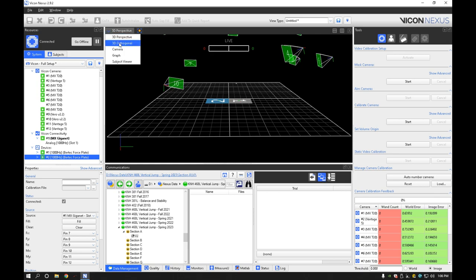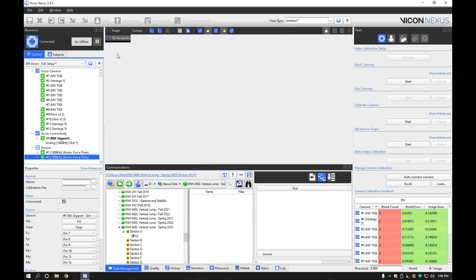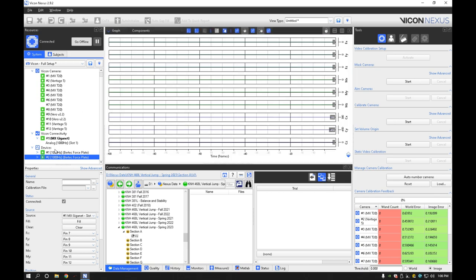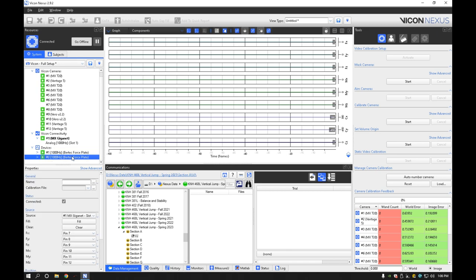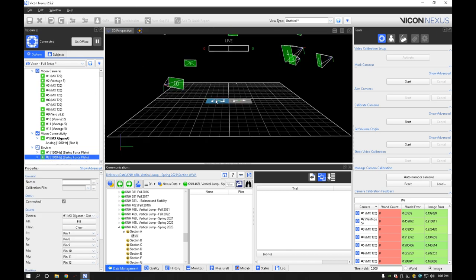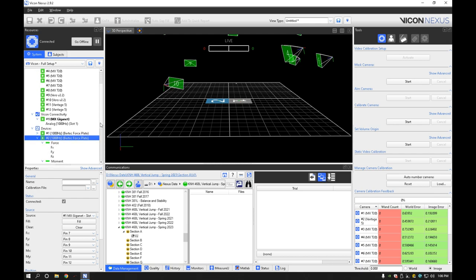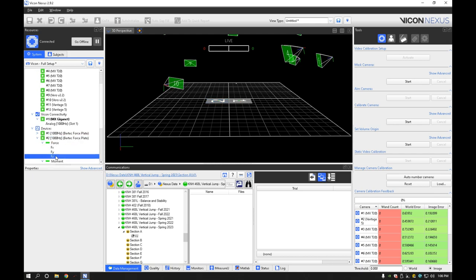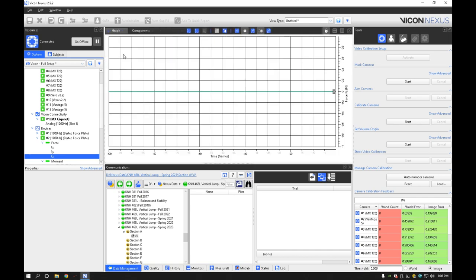I'm going to go ahead and turn on the graphs for these. So they should be reading zero except for the center locations. Perfect. So from our 3D perspective, we're going to be probably on force plate 2 for most of our people unless you're having them jump off the other force plate. But what we'll do is we'll bring up force here. I just want FZ. That's the only component we are particularly interested in for this.